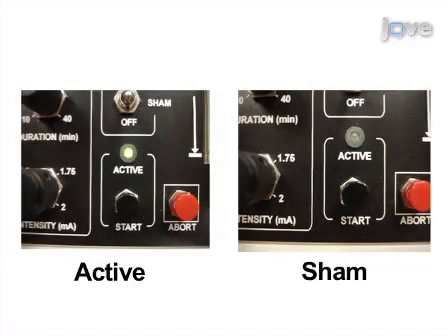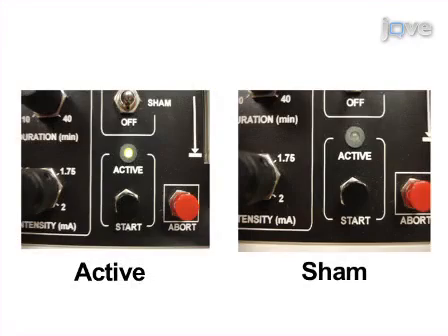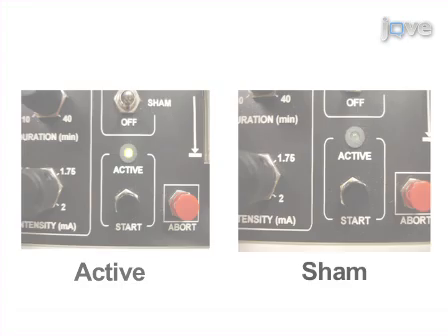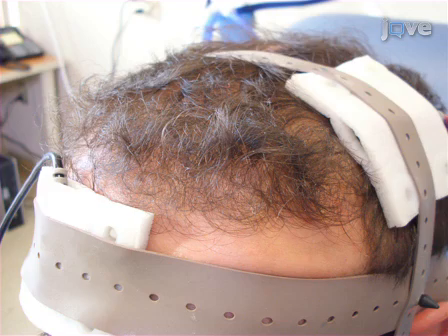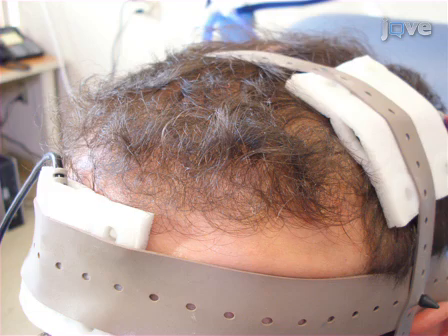With proper setup, the TDCS device should indicate that current is flowing during active stimulation, or display sham mode when running a sham stimulation procedure. Even with the device indicating current flow, current might be shunted through the skin. To avoid this, it is recommended to have sufficient distance between the electrodes — according to modeling studies, at least 8 cm when using 5 x 7 cm electrodes.